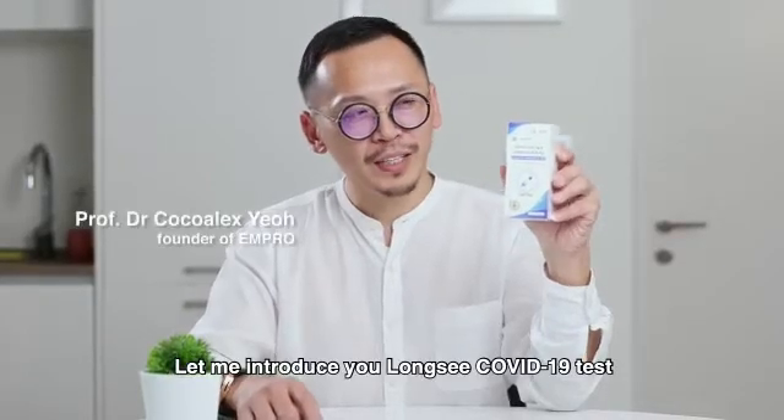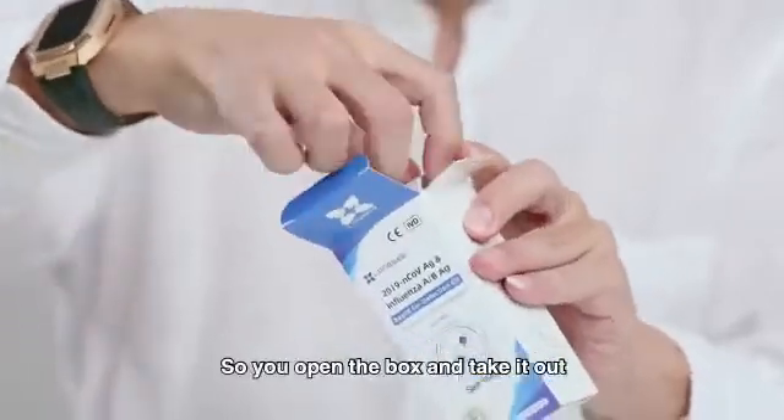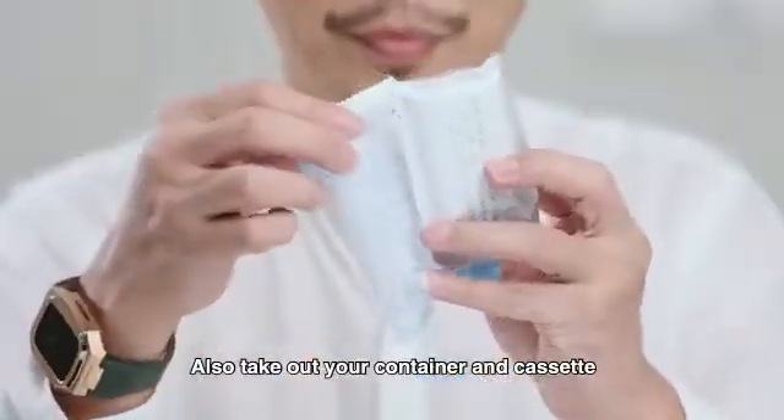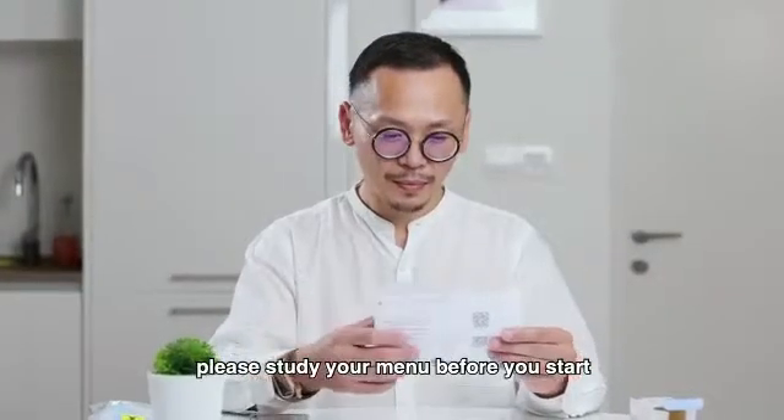Let me introduce you to the Longsi COVID-19 test. It's a self-test with the Influenza AB. So you open the box and take it out. Also take out your container and cassette. Before you do it, please study your manual before you start.